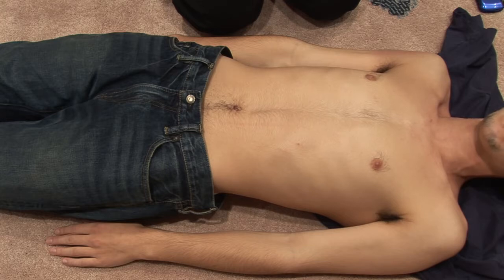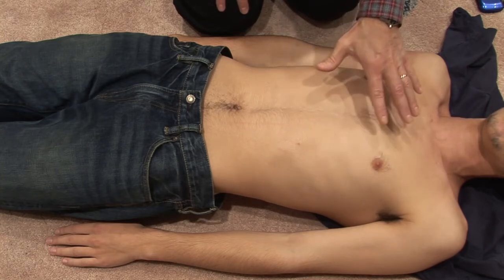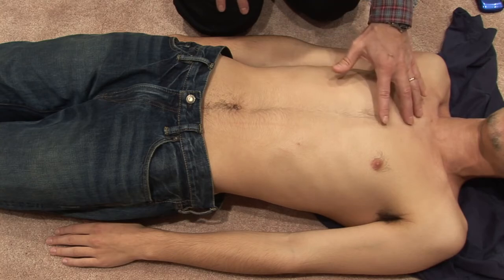Because in order to put the ECG electrodes in the proper place, you have to be familiar with the anatomy. I've seen a lot of people put the ECG leads in the wrong place, the electrodes go in the wrong spot, and then it makes the ECG look abnormal when it isn't. So let's go over the anatomy of the chest.